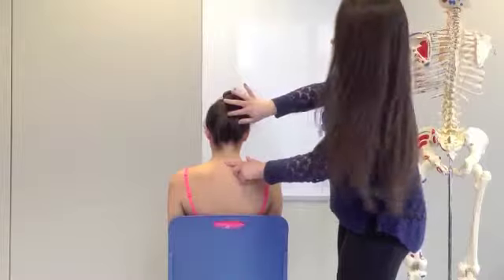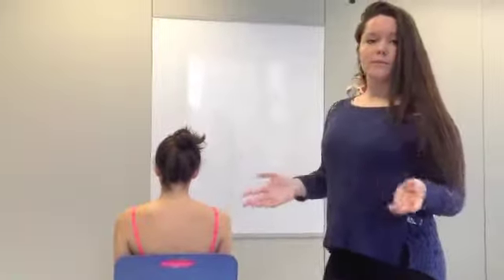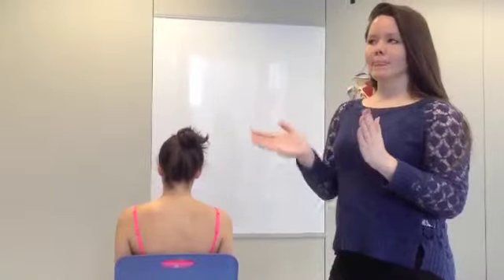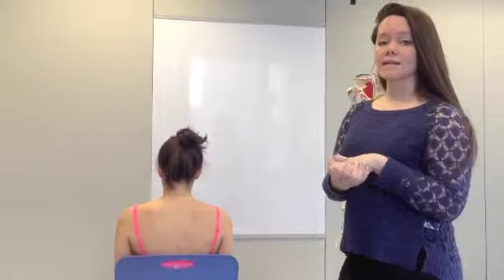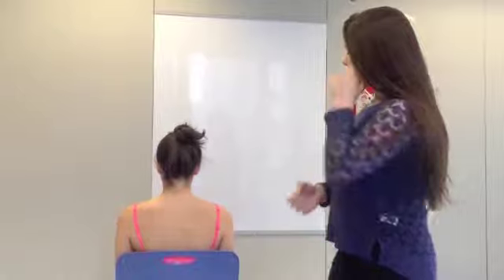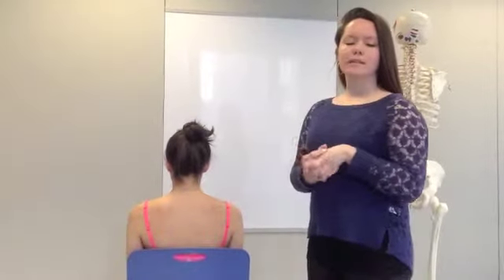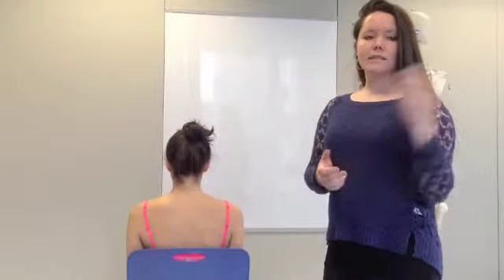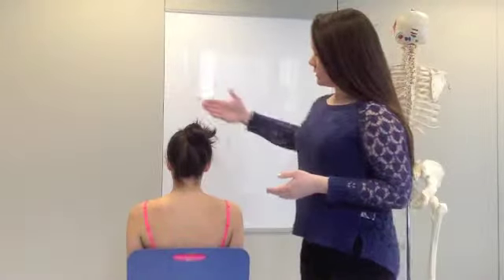It's very important to make sure that all of your landmarks are exposed while you're doing these measurements so that you can visually see and make sure that your alignment of the goniometer is correct while you're making these measurements. Additionally, it's really important to make sure that the motion that you are measuring and observing is purely in the frontal plane, so in this plane right here.